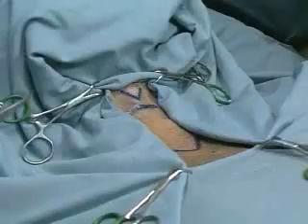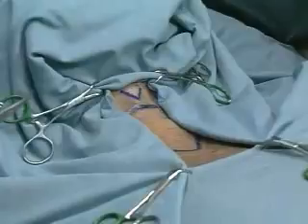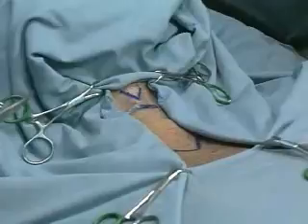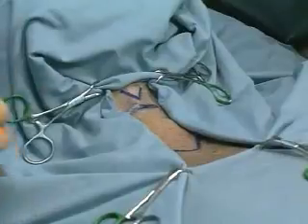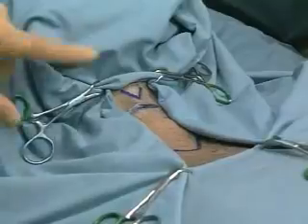The patient should be positioned supine with the neck in neutral position. In trauma patients, care must be taken to protect the spinal cord, as a cervical spine injury must be presumed until radiologic and clinical examination have excluded this diagnosis. Sterile prep and drape the anterior neck if time permits.